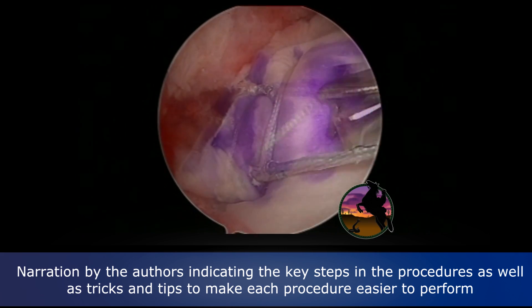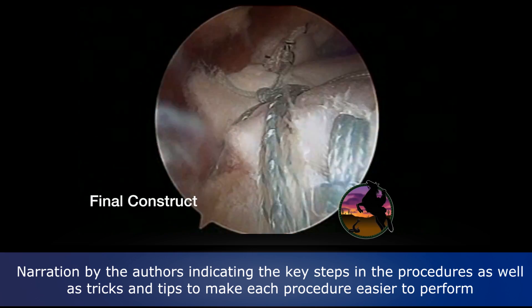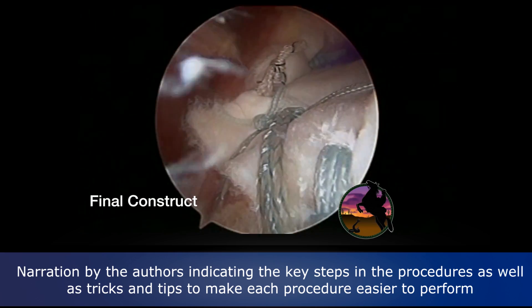You see how we get a very secure repair there medially as well. And here's our final construct after this has all been done.